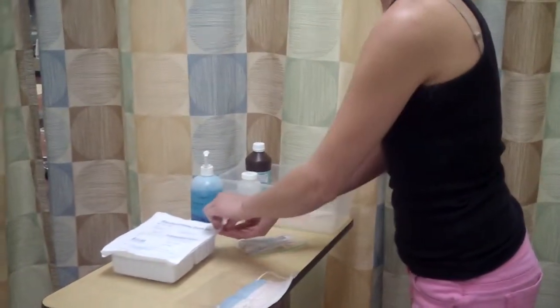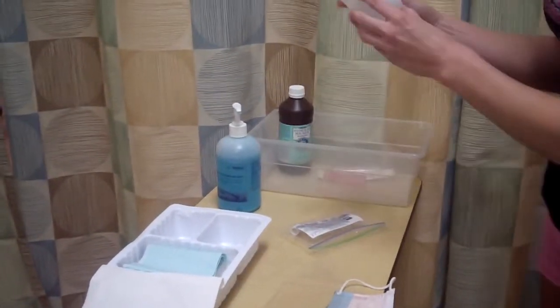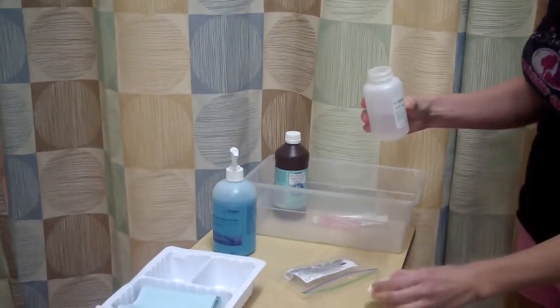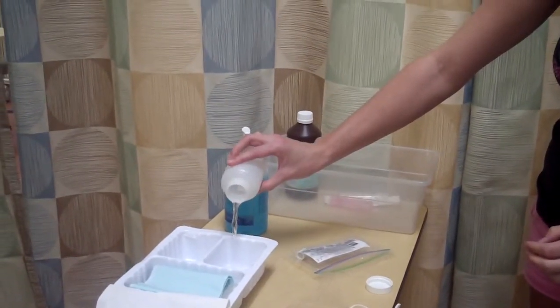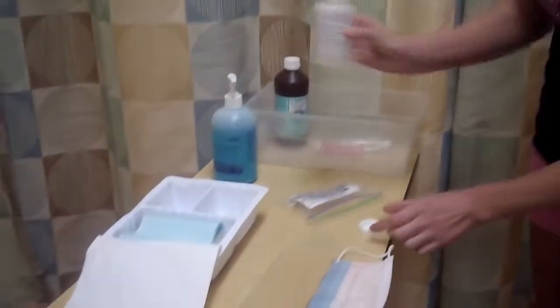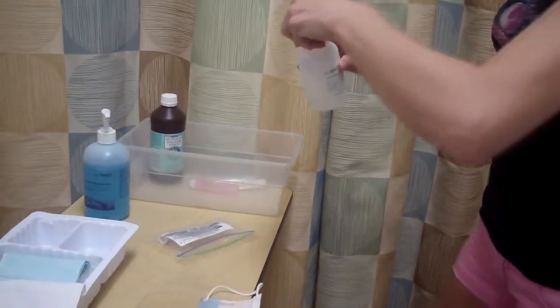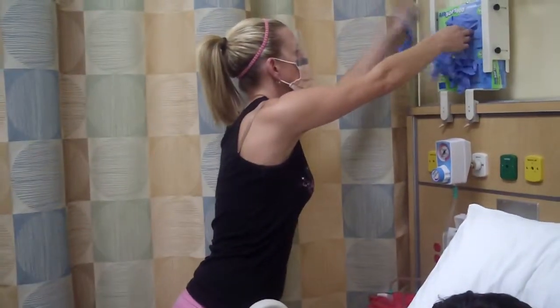And I'm going to come over and open my sterile field. Grab the saline, check that it is saline and it's not expired. Open it and place the cap facing up. Bring it over here, not touching the field while I'm pouring it or reaching over. Put the cap back on. I would then put on my mask and put on clean gloves.